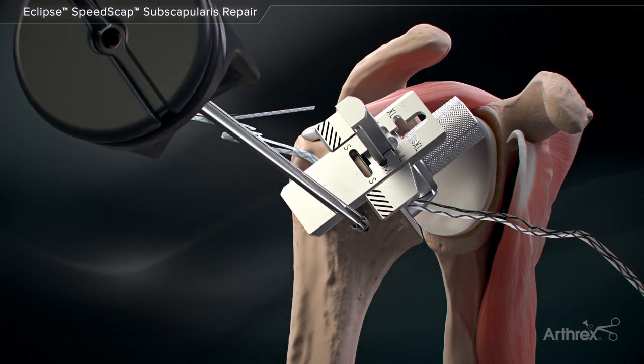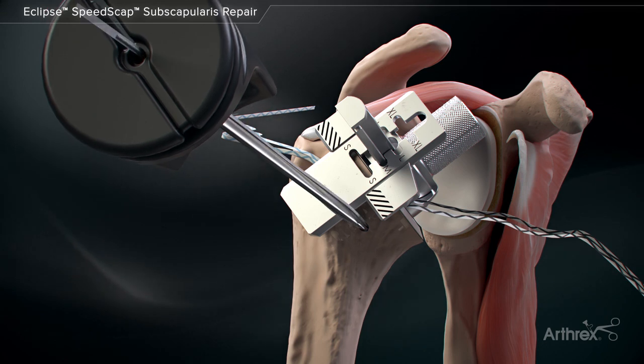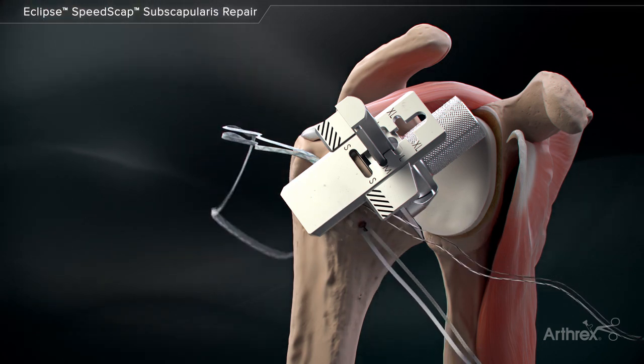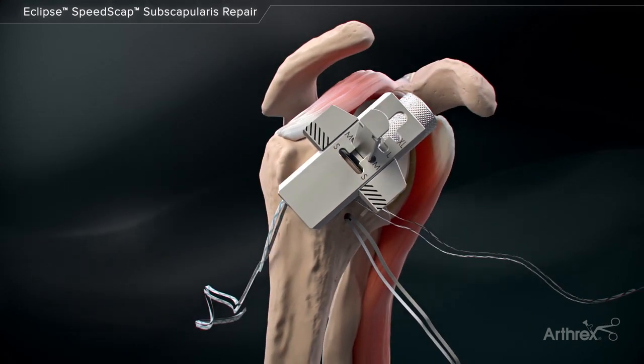After drilling, insert a FibreTac DR anchor, remove the driver and set the anchor. FibreWire suture can be removed from the anchor or retained for use later in the repair.